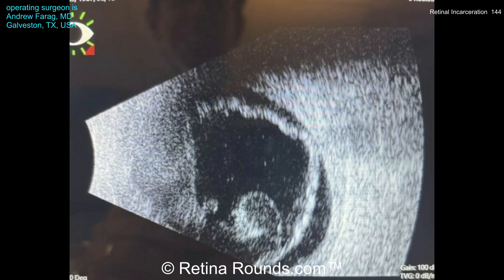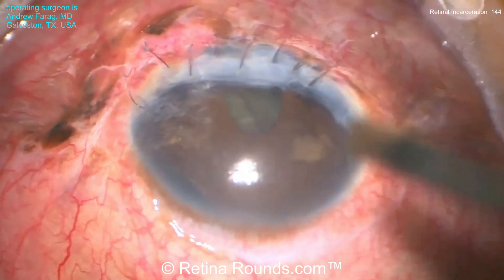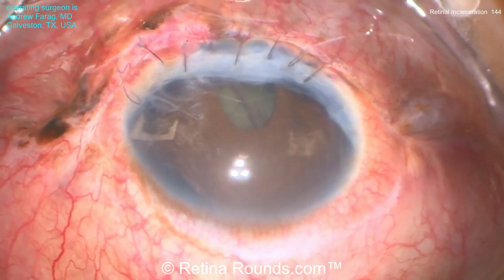His vision is hand motions and intraocular pressure is 11. Here's the vertical axial B-scan showing a subluxated crystalline lens and total retinal detachment. On kinetic exam, the retina appears to be mobile without stiffening or fixed retinal folds. Let's check out the management of the case.